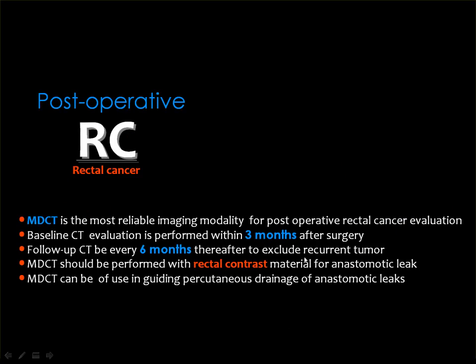Then the last issue in this lecture is to evaluate the post-operative normal appearance and the complications. It's worth mentioning that CT is the most reliable imaging modality for post-operative cancer evaluation.